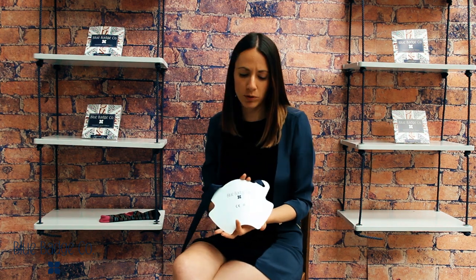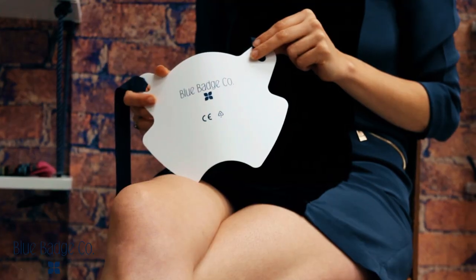I'm going to show you how to use our sock aid which is a simple solution for putting on socks and stockings for those who have limited strength or mobility. This neat, well designed product comes supplied with full instructions including a three step diagram.